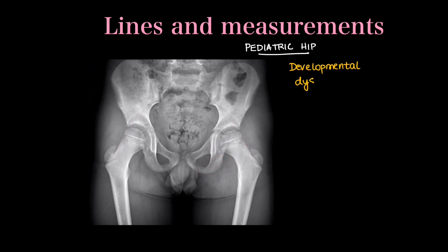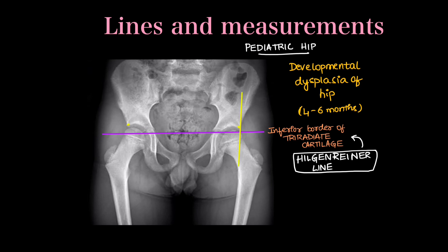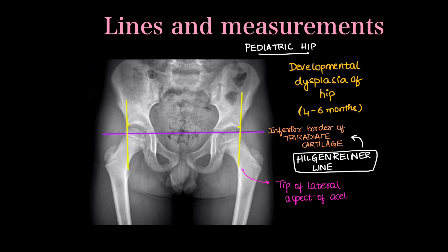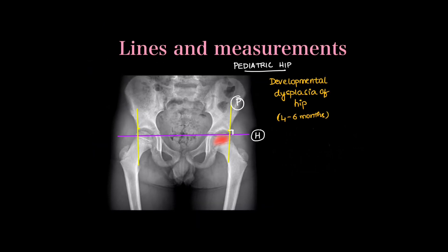Hilgenreiner's and Perkin's lines are drawn in cases of suspected developmental dysplasia of the hip in pediatric x-rays, typically in a 4–6 month old child. Hilgenreiner's line is drawn along the inferior aspect of the bilateral tri-radiate cartilages. Perkin's line is drawn perpendicular to Hilgenreiner's line passing through the tip of the lateral aspect of the acetabulum. These two lines are thus perpendicular to each other, creating four quadrants around each hip.